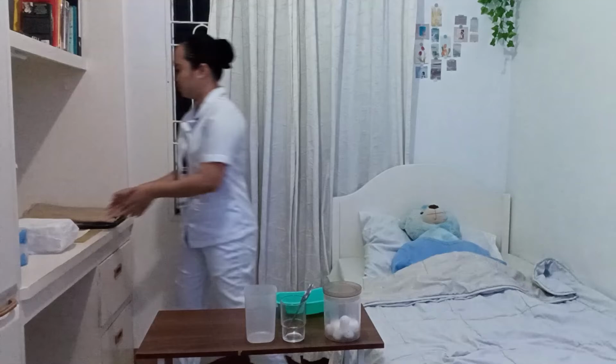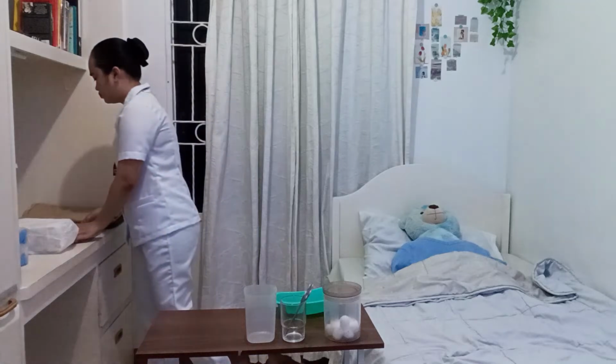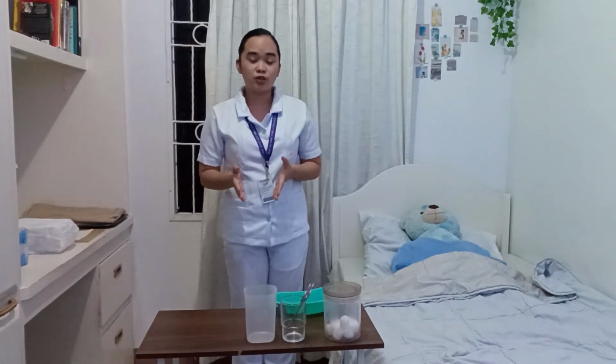So prior to the conduct of the procedure, I am going to check the physician's order for catheterization to ensure that I have the right patient for the right procedure. So now I'm going to perform thorough hand washing to deter the spread of pathogenic microorganisms which causes disease and contamination.